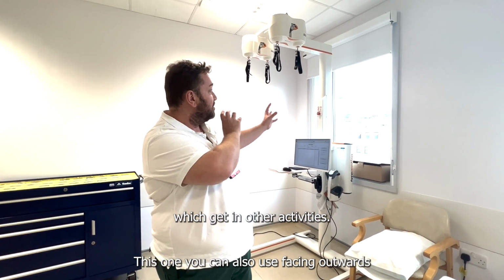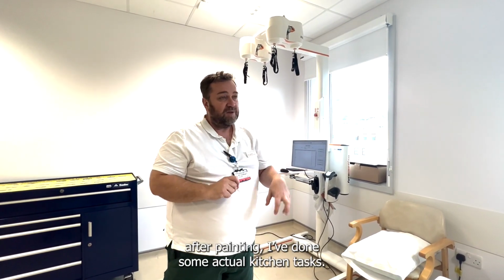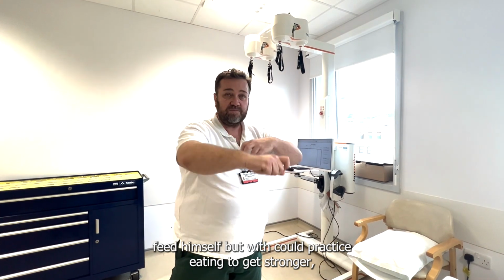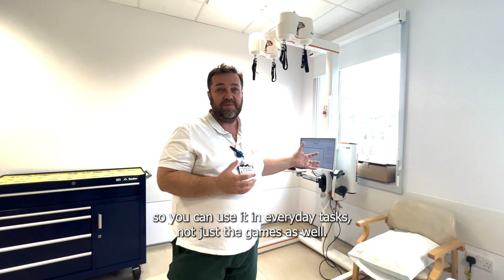This one you can also use facing outwards and give people an actual activity to do. So I've done painting, I've done some simple kitchen tasks. We've had a gentleman recently who couldn't feed himself, but with this could practice eating to get stronger. So you can use it in everyday tasks, not just the games as well.